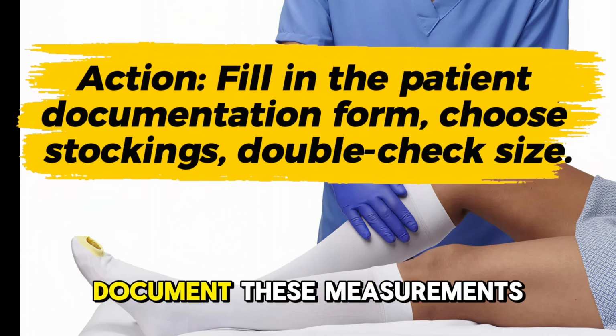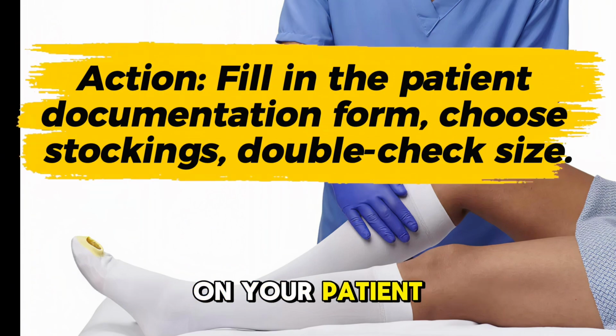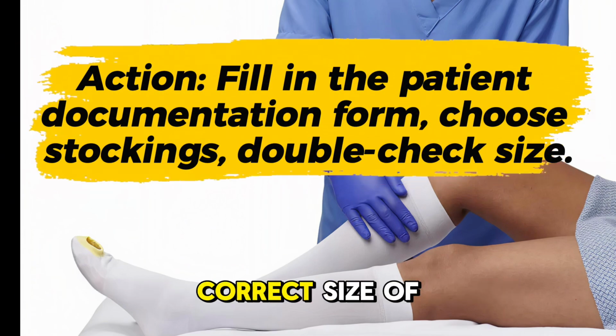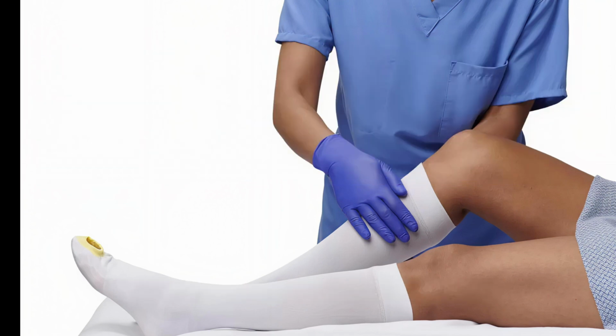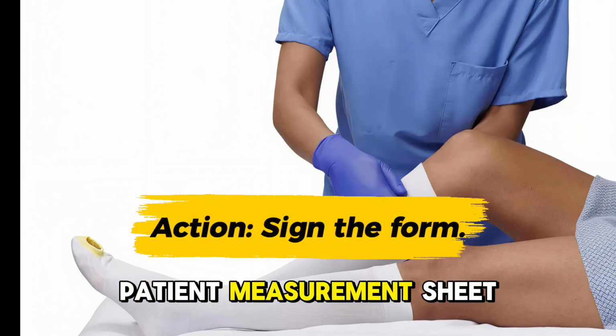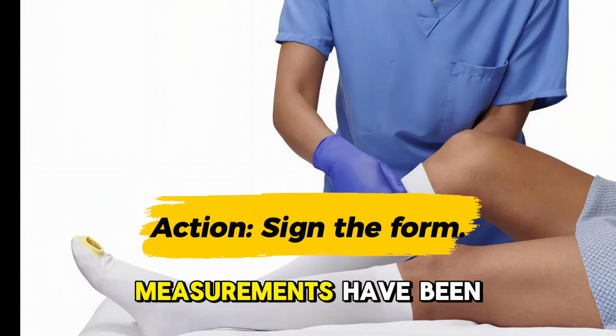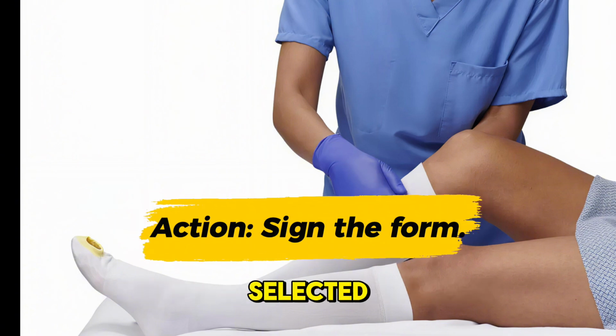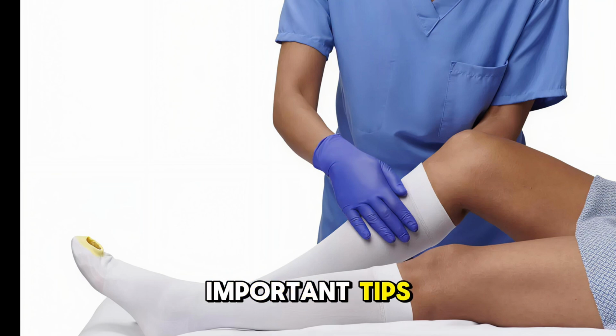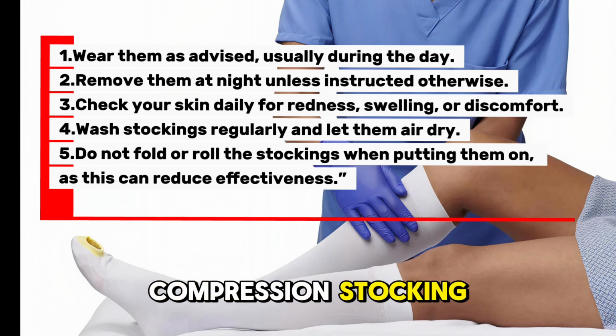I will now document these measurements on your patient chart and select the correct size of stocking according to the manufacturer's guidelines. I'm signing the patient measurement sheet to confirm that measurements have been taken accurately and the correct size has been selected. Here are some important tips for wearing your compression stocking.